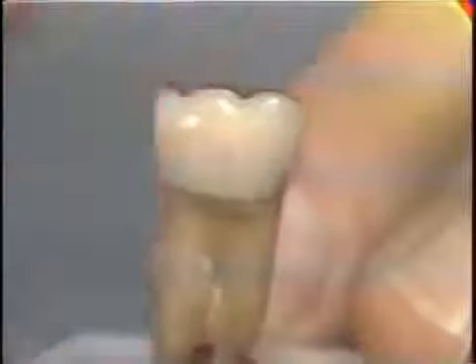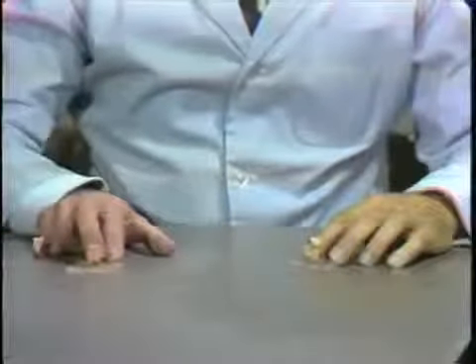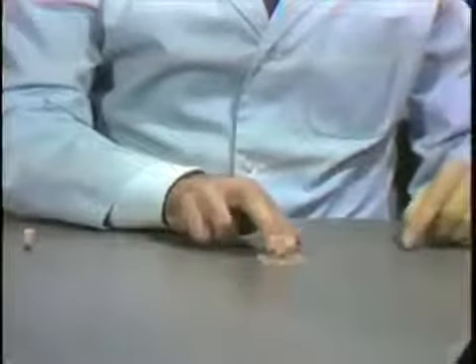So here then is the amalgam core retained with pins going into the vital dentine of a molar tooth. And this one has on it a veneer crown with a resin facing, which you see in that situation. This other model shows an earlier stage in the preparation, and you can see on this one the pins going into a vital molar tooth.